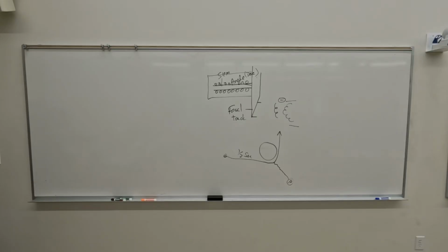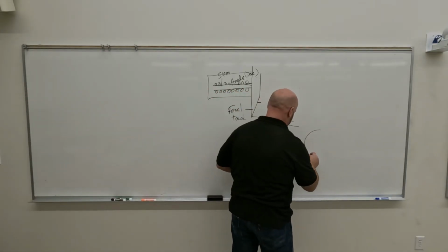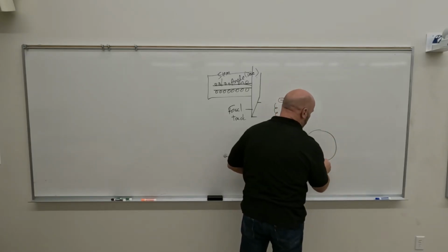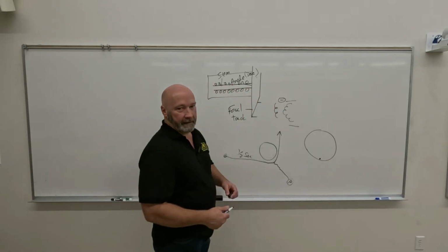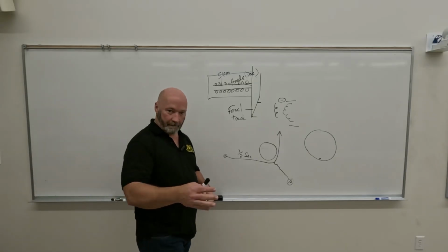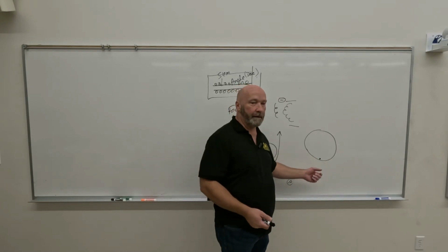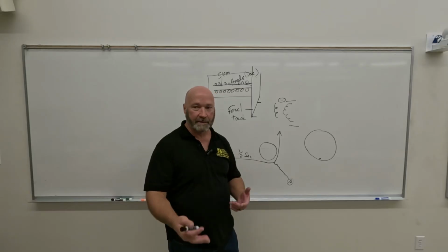The reason that we rotate the anode is to aid in the conduction. So let's say we've got an anode. You know, we've got an anode face, and the only place that we place the electrons is here. We don't rotate it. Then what do we get? Melting. We get that stationary anode that I showed you. Eventually it's going to melt. A lot of exposure's going to etch first, and then over time it's just going to melt.